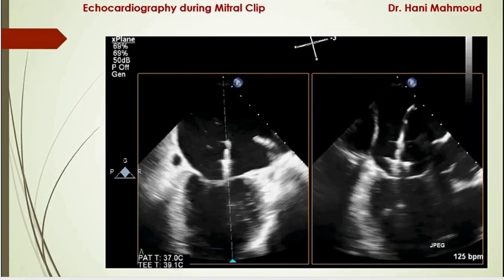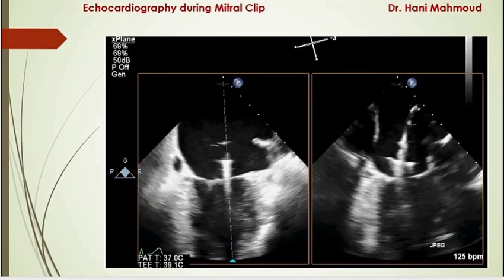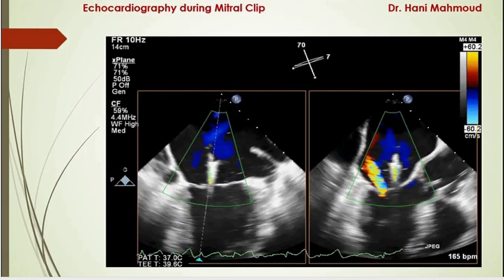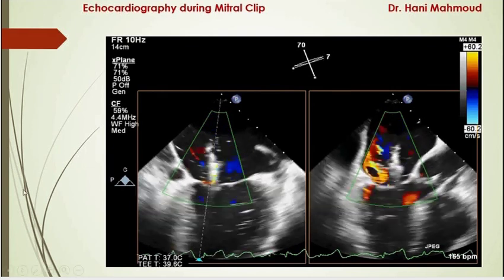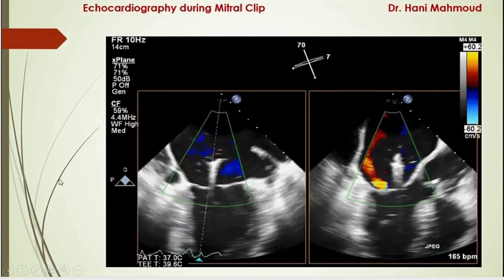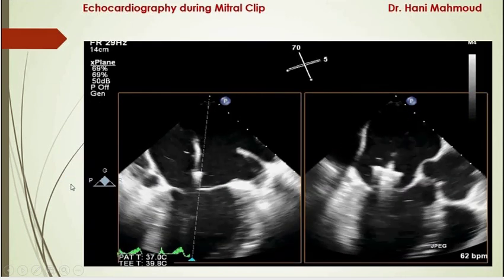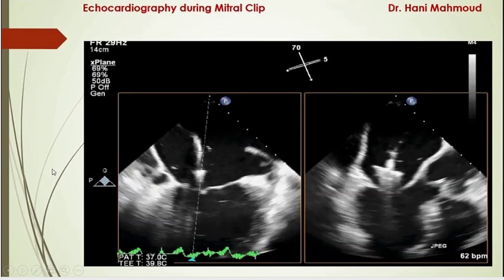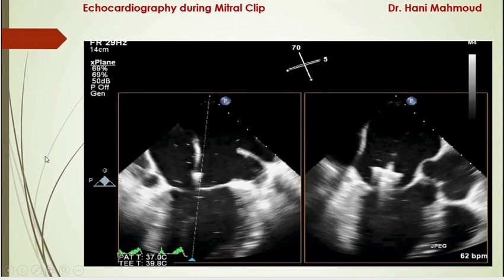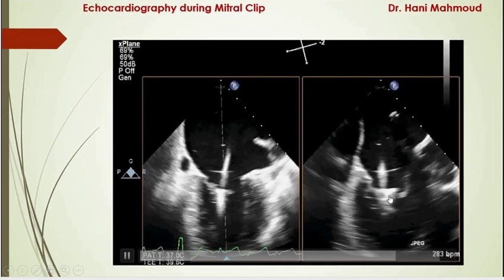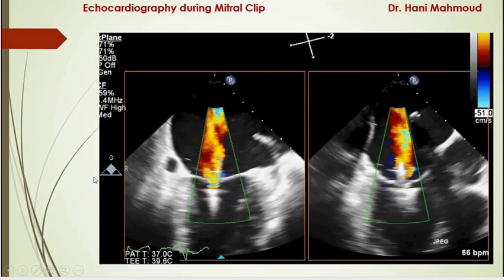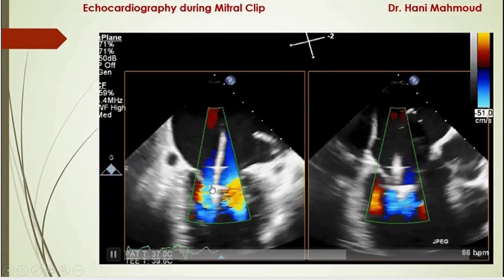The interventionist then introduces the opened mitral clip through the mitral valve itself. By applying color Doppler, we should see the clip bisecting the color signal — this is the key finding we need to confirm during this step. The interventionist can also push and pull the entire system to observe the behavior of the clip while it dives into the left ventricle. Once the clip is inside the left ventricular cavity with arms open, color confirms the clip is bisecting the color signal correctly.